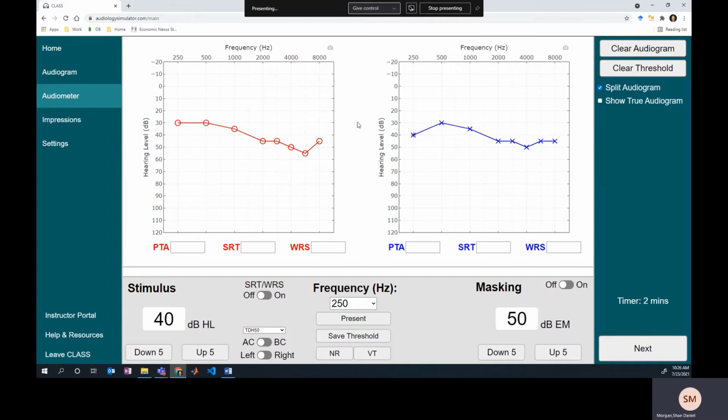But if they respond 2 times out of 2 presentations, you're at 100%, especially if they're hearing it 0% at the level below that. You don't need to bother testing it that 3rd time to make sure it's 50%. You technically still should. It's good practice. The program will give you a little nudge to remind you in the output files that you should probably do it 3 times, but you don't have to.